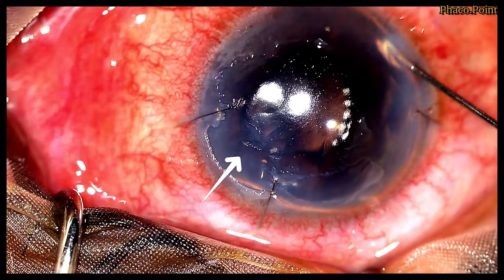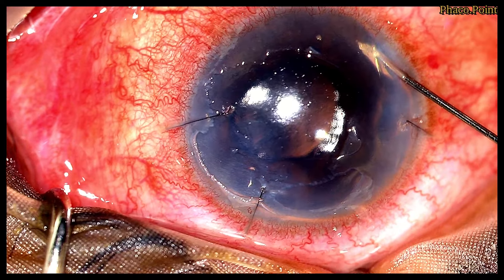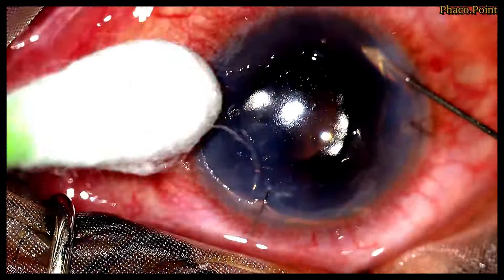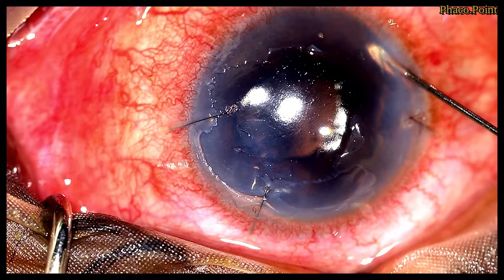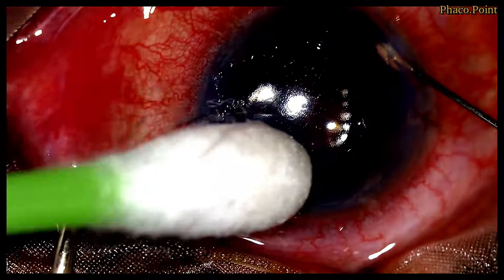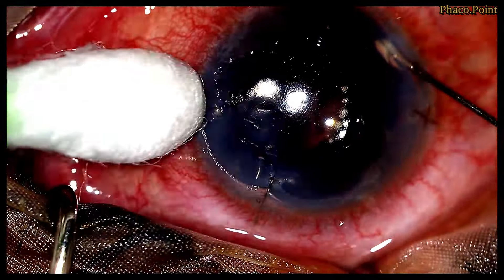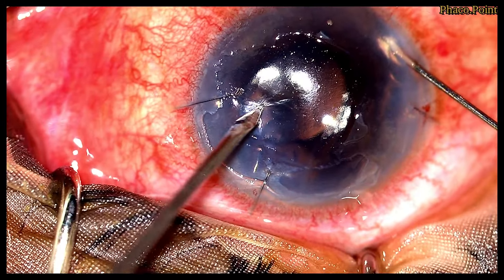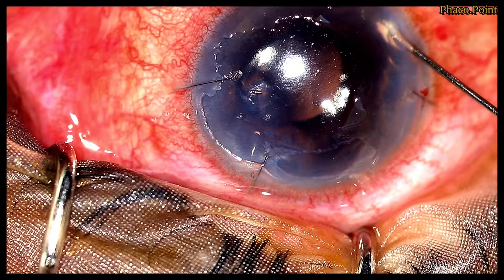I'd like you to look at this particular venting incision that has been marked. You will notice a bead of fluid appearing as I inject some gas. This implies that there is still fluid between the detached Descemet's and the overlying corneal stroma. An intermittent injection of gas allows fluid to consistently keep coming out until the Descemet's is completely attached. If within a couple of minutes I still see some residual haze, I make another stab incision to aid reattachment.